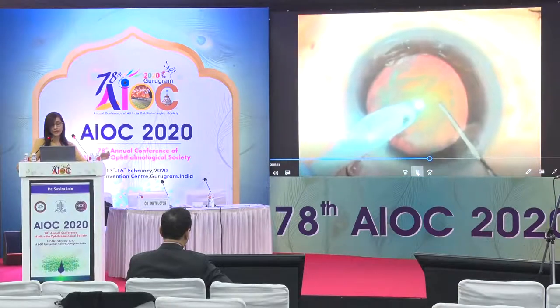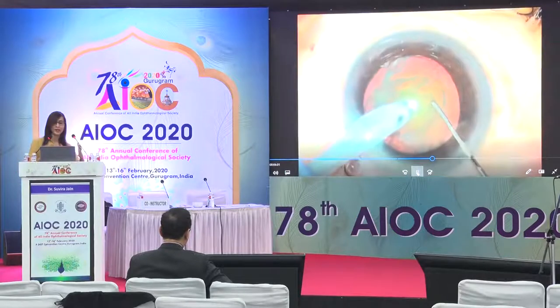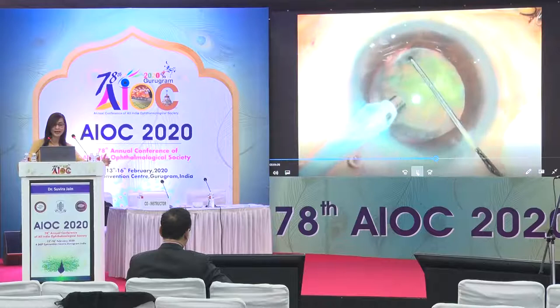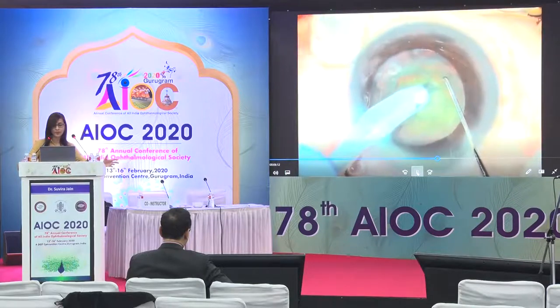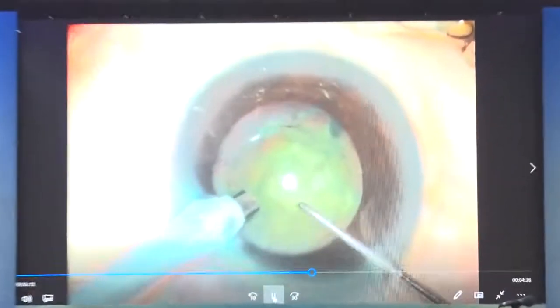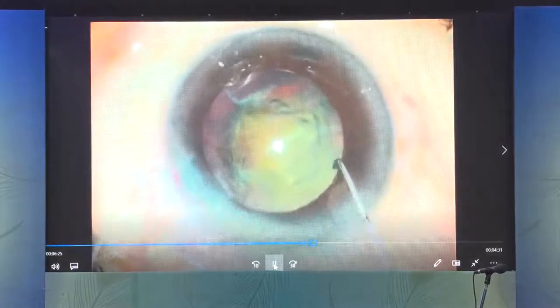When doing a direct horizontal chop, especially for slightly harder cataracts, you never have such a wide lateral separation. In this case, the surgeon has a wide lateral separation and actually yanks the nucleus around — which would be safe in a normal cataract — then performs a second chop. When attempting to rotate the nucleus for the third chop, those maneuvers alone resulted in opening up of the posterior capsule.